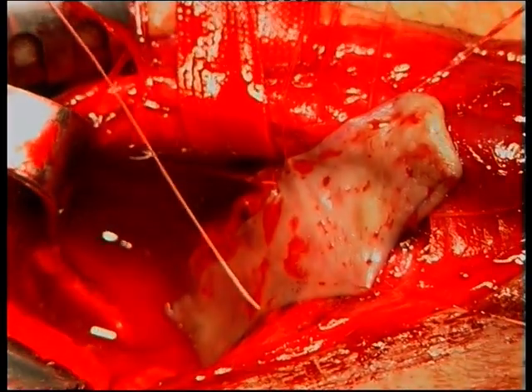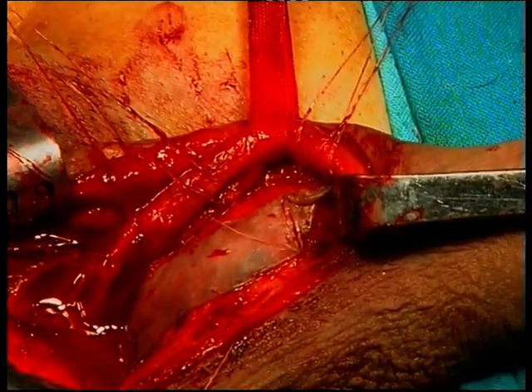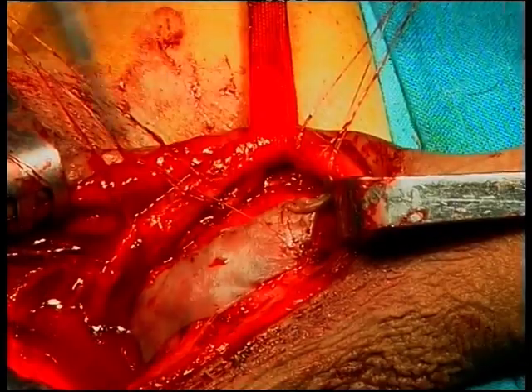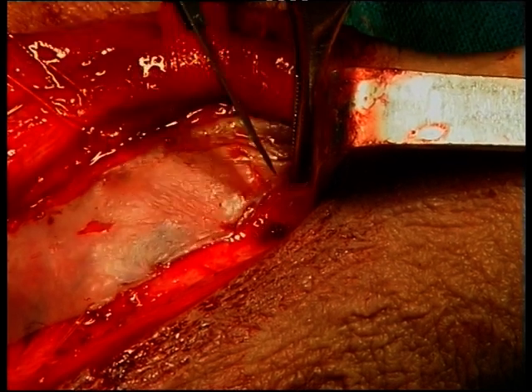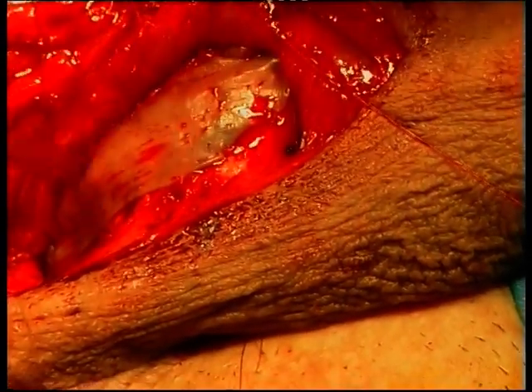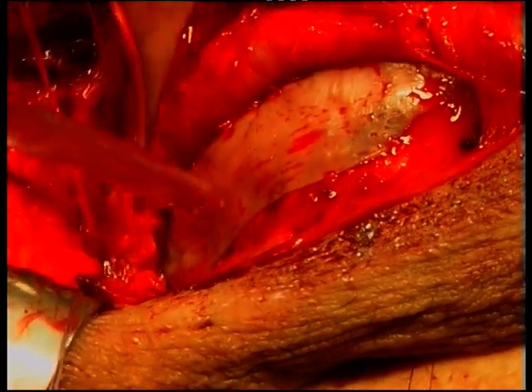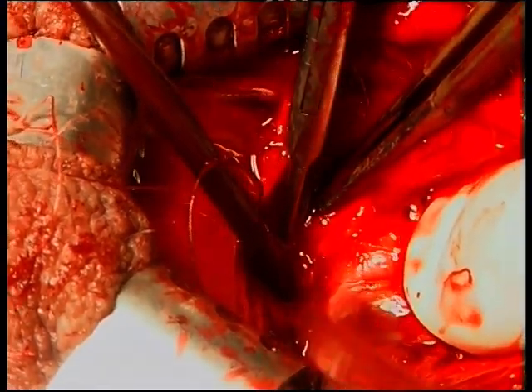The spread fixation of the graft onto the albugineal surface also reduces the chances of graft shrinkage and contracture. We can see that in this case the graft was oversized in length and had to be trimmed to its proper length. Final aspect of the mucosal graft spread and fixed onto the albuginea of the corporal bodies.